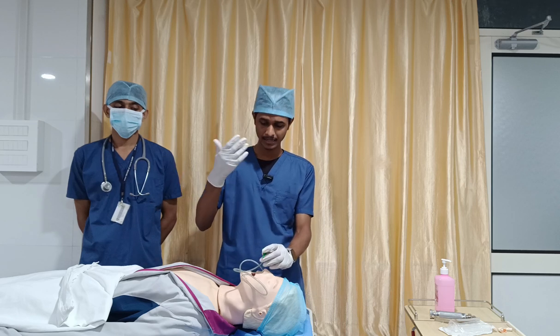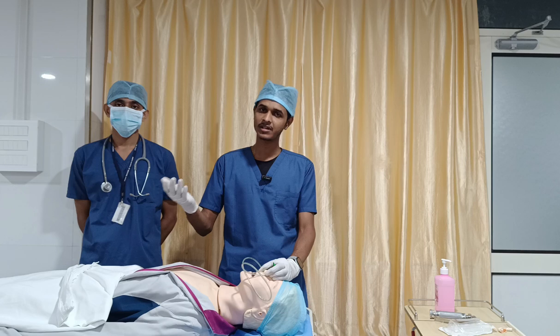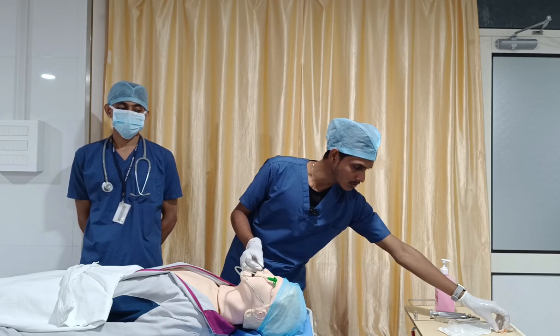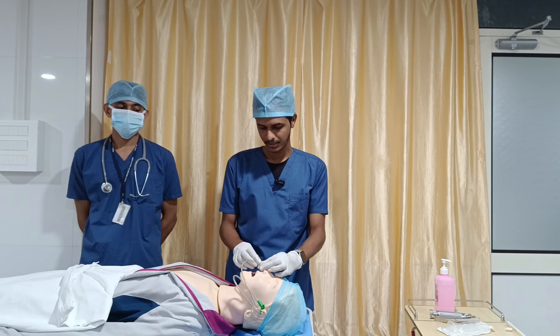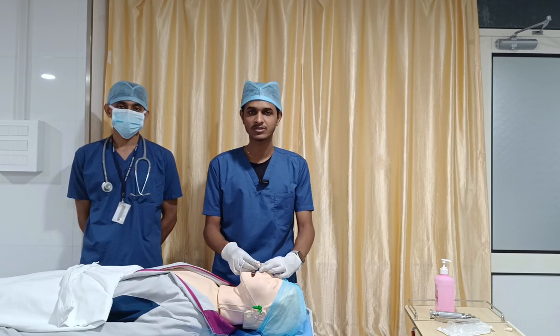Fourth thing, there is a definitive way, you can take an X-ray and thereby also confirm. After confirmation you have to fix the catheter. Okay, so this is the way you have to do the Ryles tube procedure.